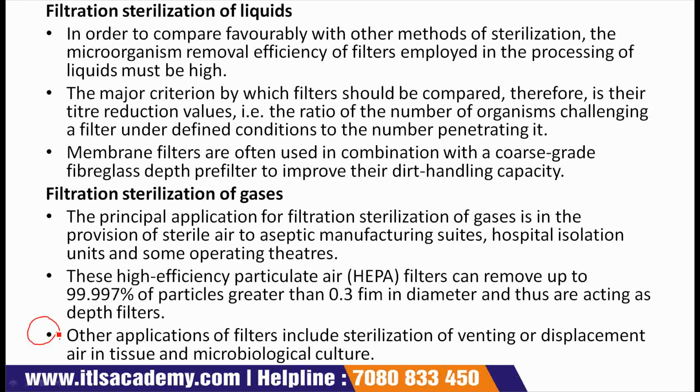Next point. Other applications of filters include sterilization of venting or displacement air in tissue and microbiological culture.